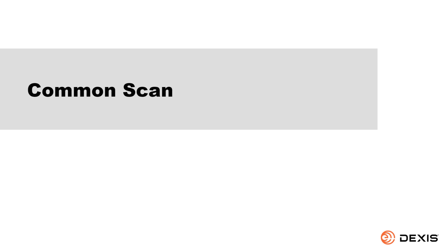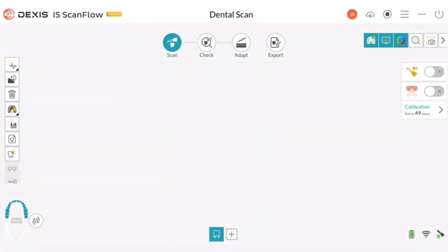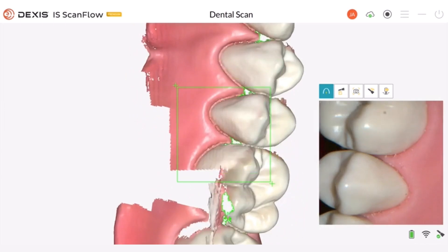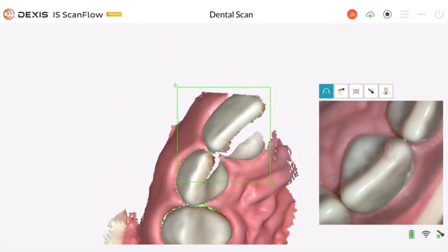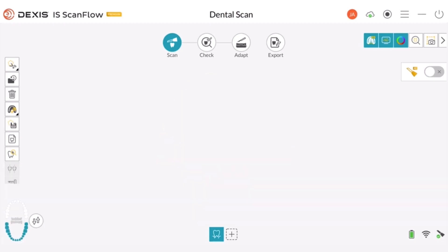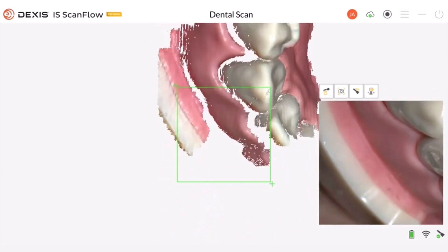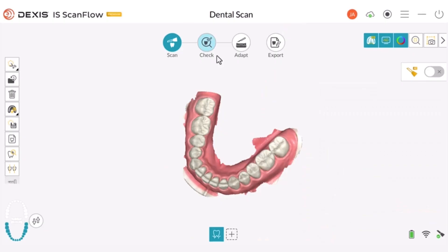Common Scan. Capture the current crown or bridge with bite position to help promote aesthetic accuracy of the prosthesis to be fabricated. Scan the maxillary arch, scan the mandibular arch, and acquire a bite scan.